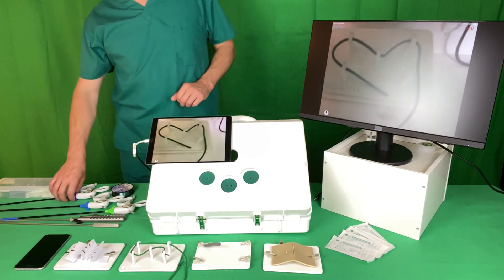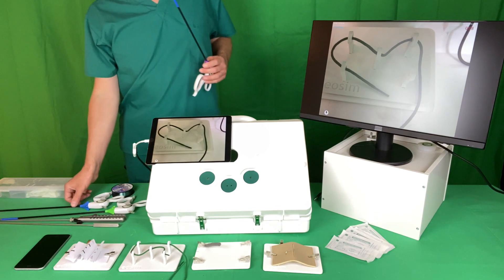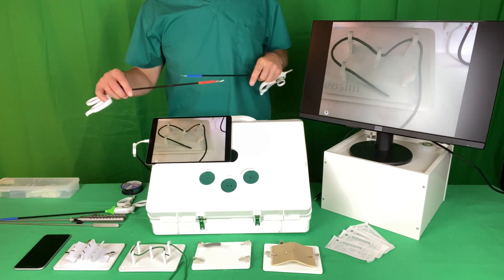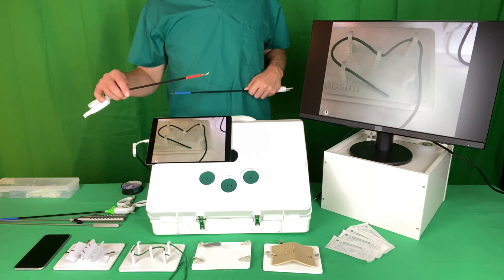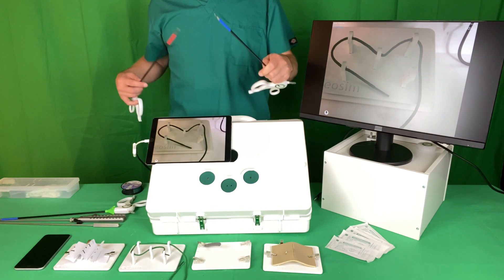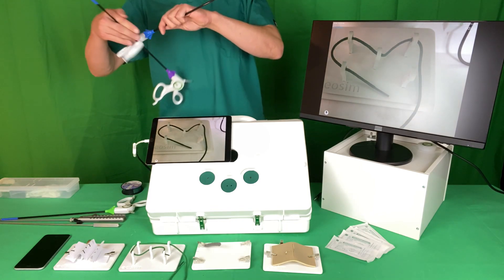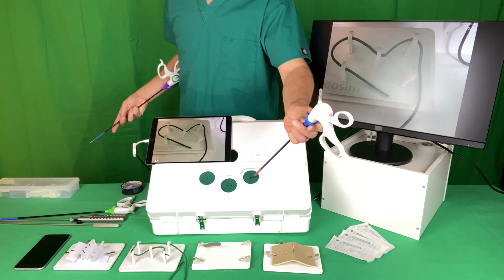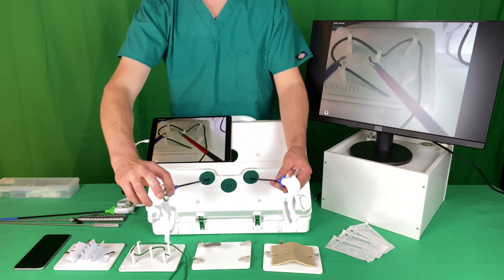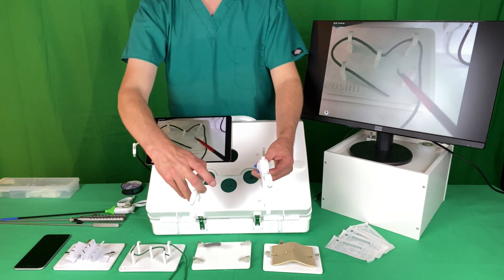That starts up the camera. You take your instruments — some stickers will come with them. Place a red sticker on the instrument you're going to use in your right hand and a blue sticker on the instrument for your left hand. Put these in through the ports and you undertake your task.